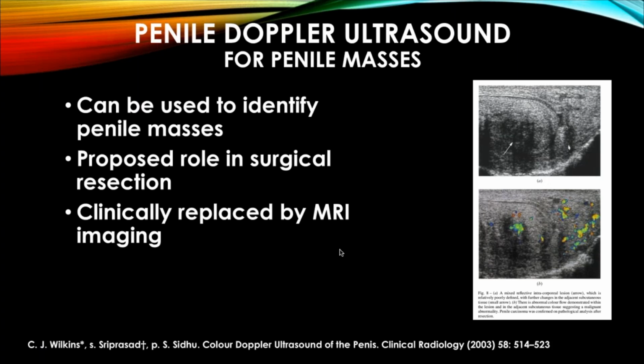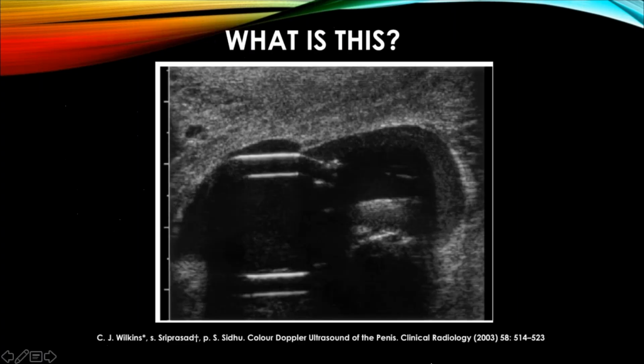Now, I will tell you that occasionally a patient will come to the emergency room and a physician, they usually present with chest pain and priapism. This is a very difficult situation. When they have chest pain and priapism, the ultrasonographer's role is to look to make sure they don't have one of these. So I don't know if you know what this is.